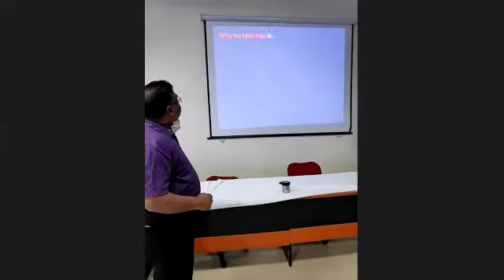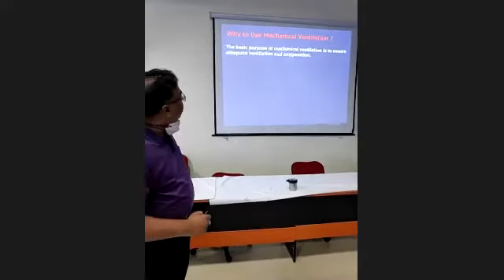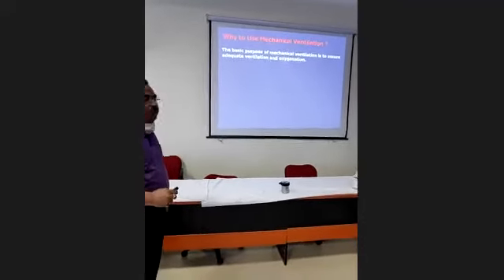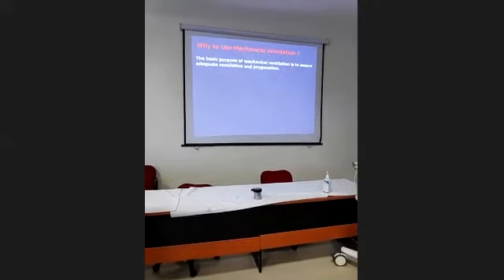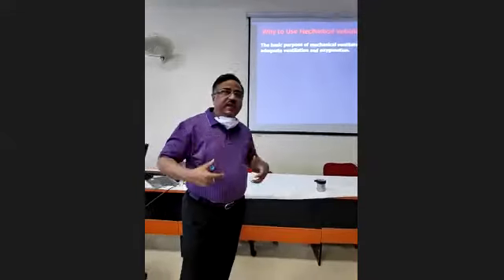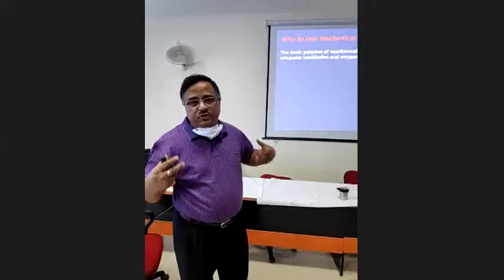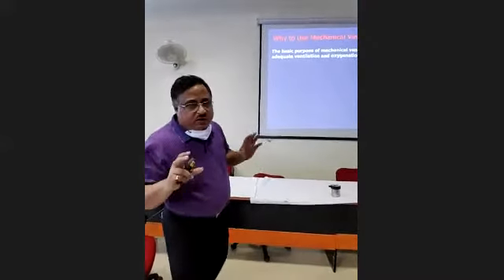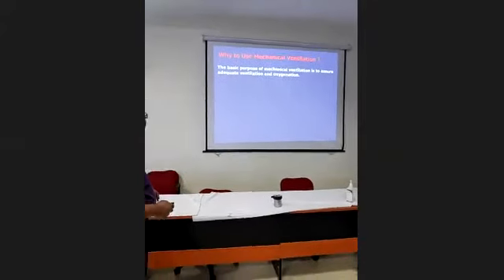Now, the next question is why to use mechanical ventilation? The basic purpose of mechanical ventilation is to ensure adequate ventilation and oxygenation. That means the patient is taking adequate tidal volume to maintain his minute volume, and he is getting an appropriate amount of oxygen going inside his body. So this is the basic purpose of providing mechanical ventilation.